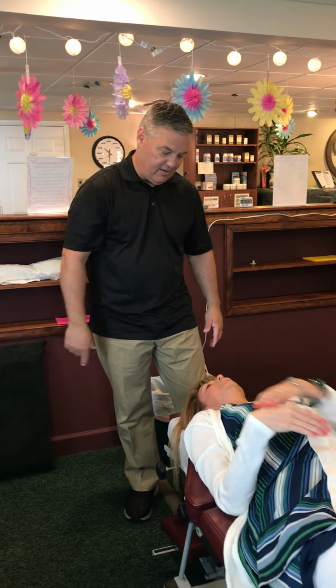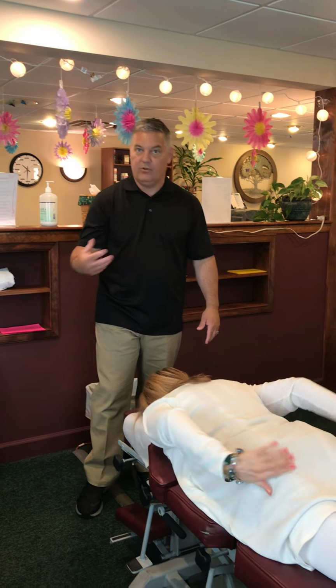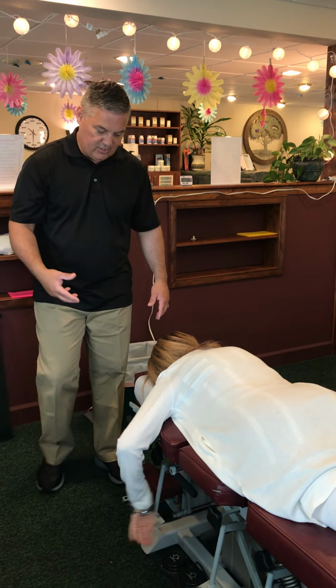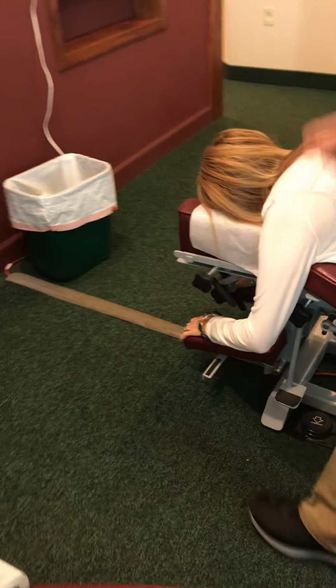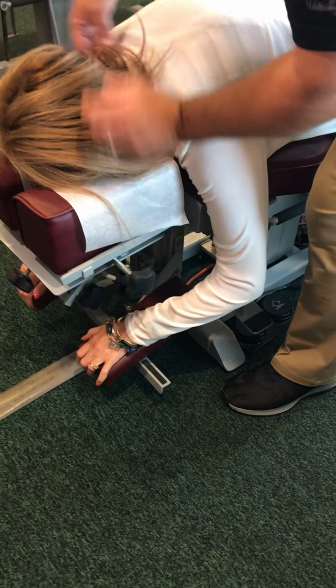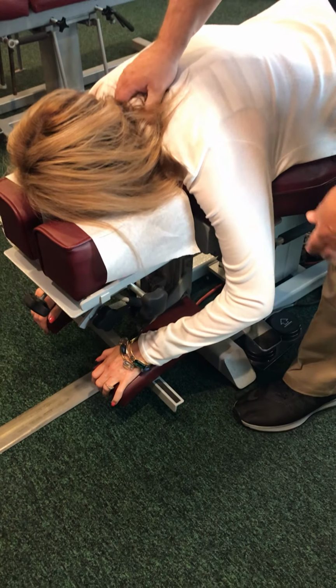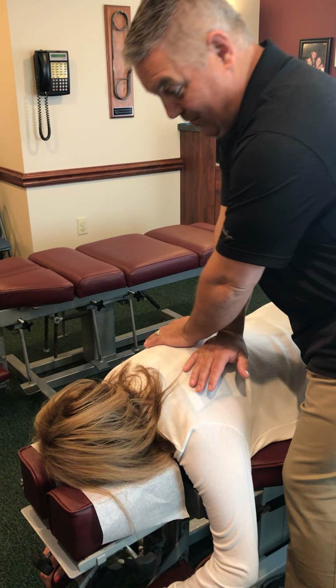So have you turn over, lay face down again for me, Cheryl. So for the drop on the cervicals, if we're doing curve correction, which is a lot of what our practice does, headpiece. And Dr. Ritchie, if you're watching this, okay, you have these tables. Lift it up, gentle push down, table drops, and pretty simple right there. And again, going back to P to A thoracics, P to A thoracic.